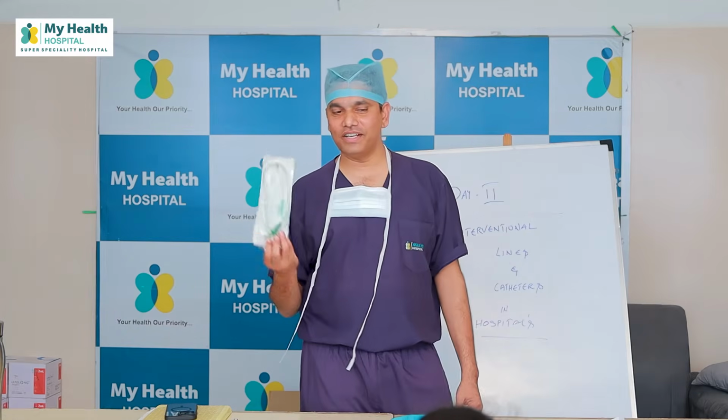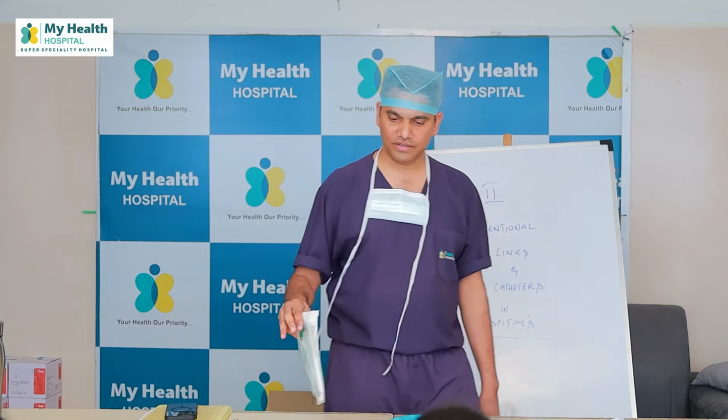Or feeding jejunostomy, the only procedure where you place it into the intestine directly, open up and place it in the intestine directly. Okay.